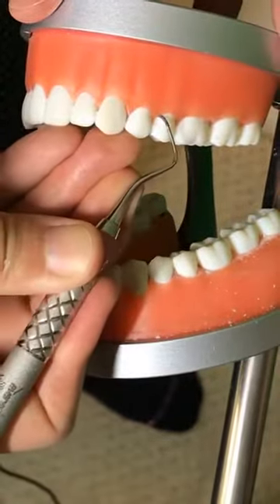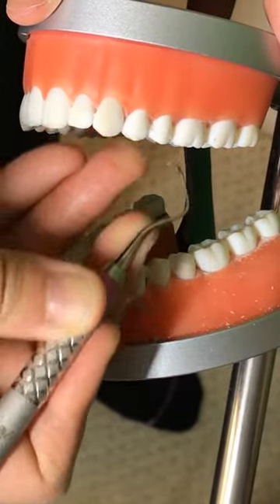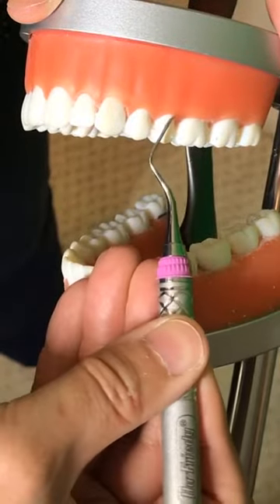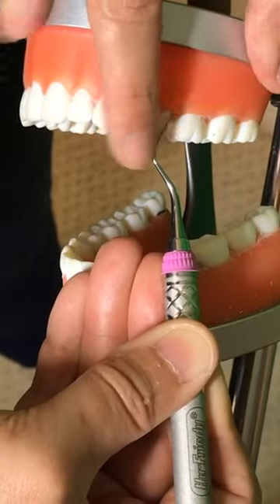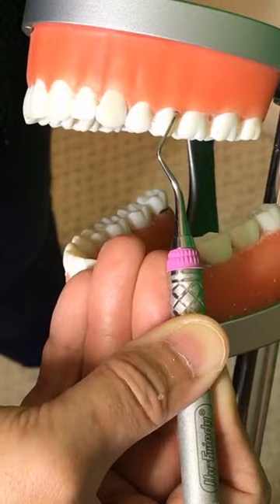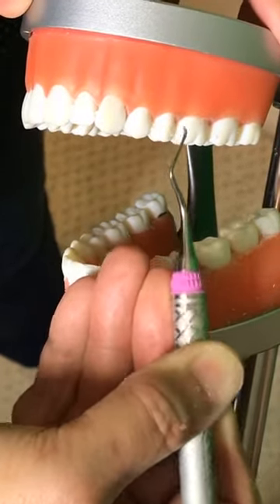If it's hugging the tooth, that's a good side to use. But if I rotate this way, distal, this is hugging the tooth, but another key principle is this bend. The V is not pointing to the distal, so this is technically not the correct end.